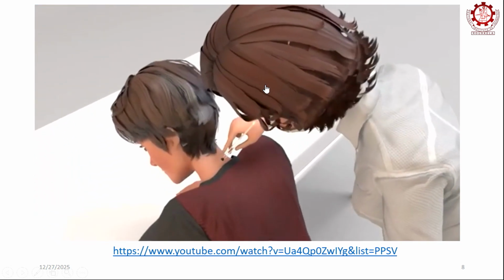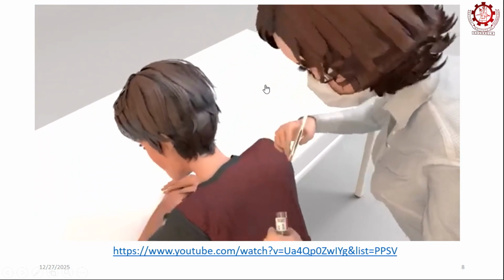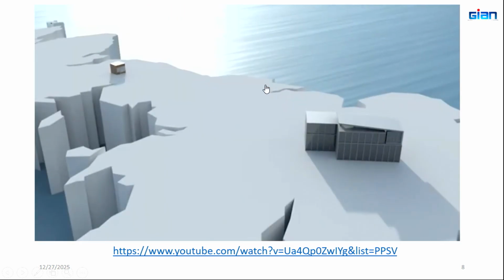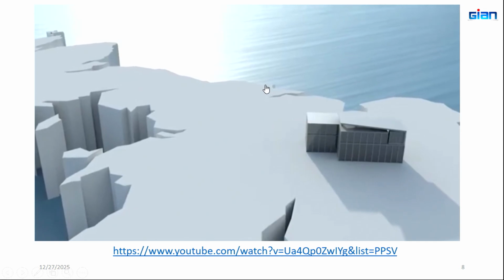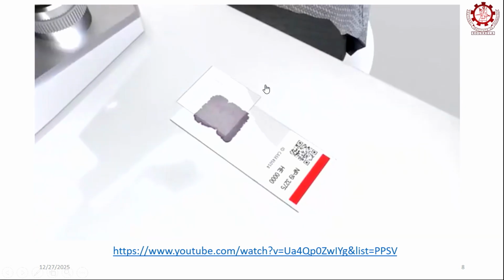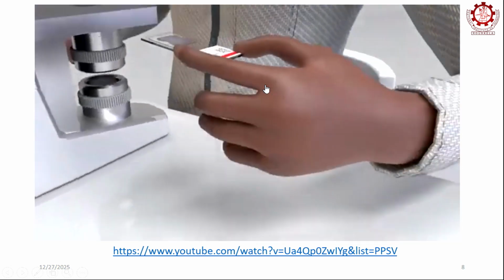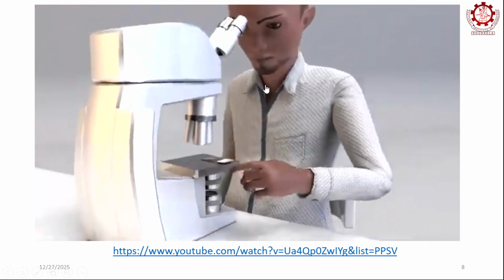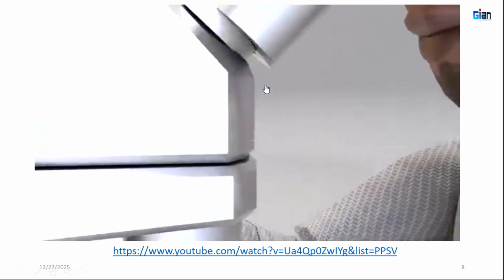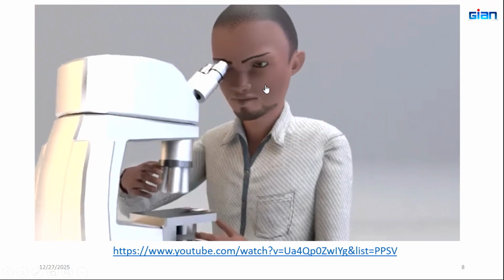The process begins with a doctor taking a tissue biopsy from the patient. This sample is then sent to a pathology lab where it begins its preparation stage. The tissue is cut into thin sections, stained, and put onto glass slides. The sample is then referred to a histopathologist. That's someone who specializes in diagnosing diseases. They examine the sample and make a diagnosis.